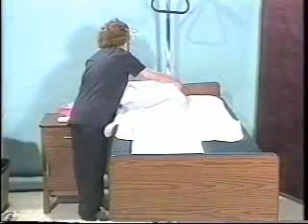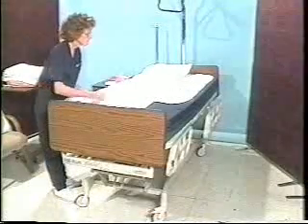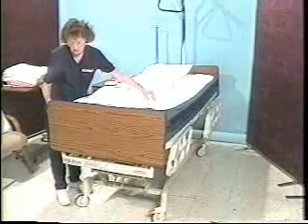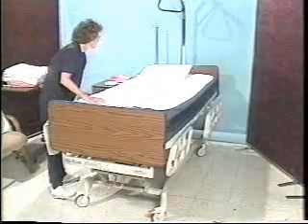The remaining length of the sheet reaches over the top of the mattress. The hem stitching is facing down. Hem stitching can be a source of skin irritation if it rubs on the patient's body.